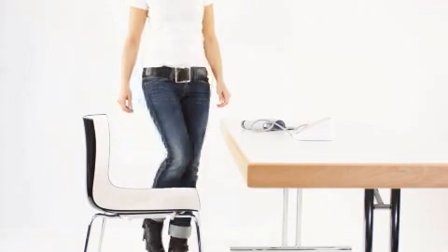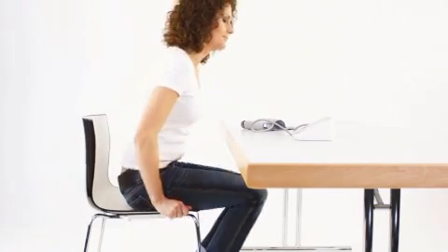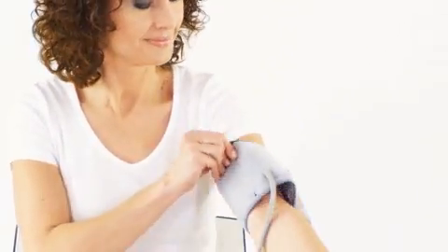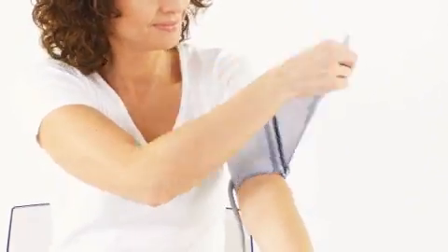Sit down on a chair in a comfortable and relaxed position and place your feet flat on the floor. First of all, you set the date and time. Then, you uncover your upper arm and wrap the cuff around it.